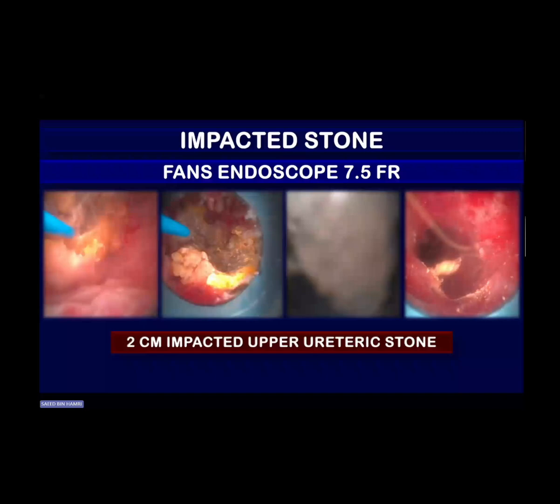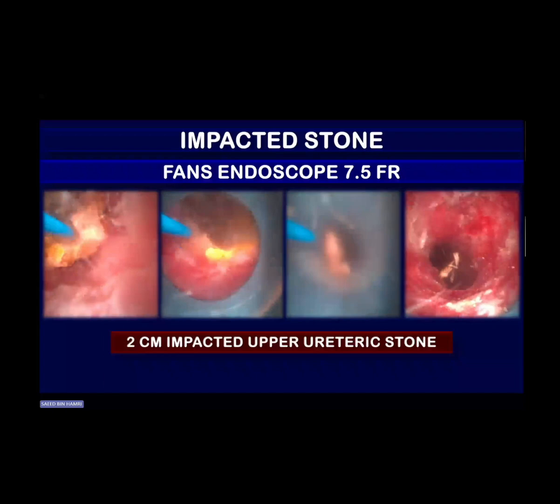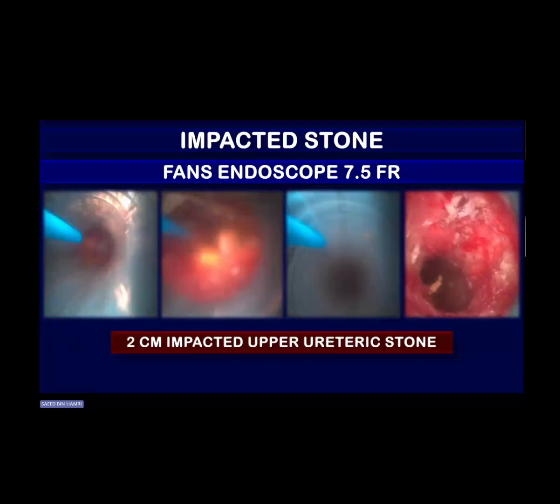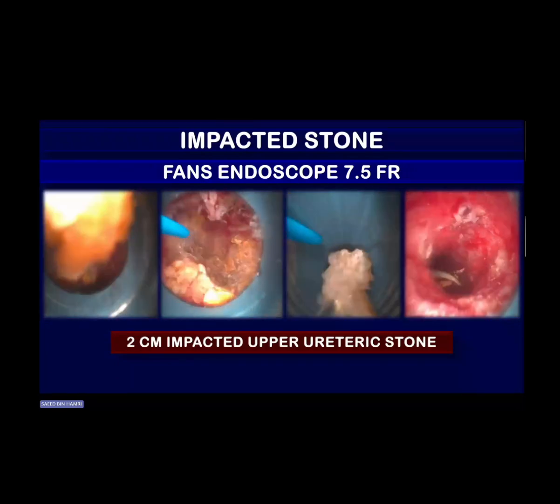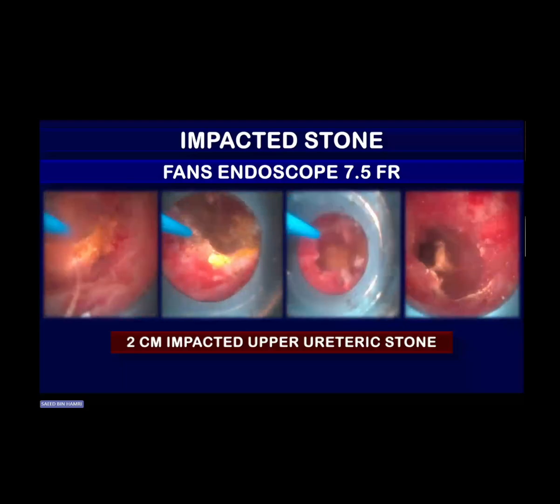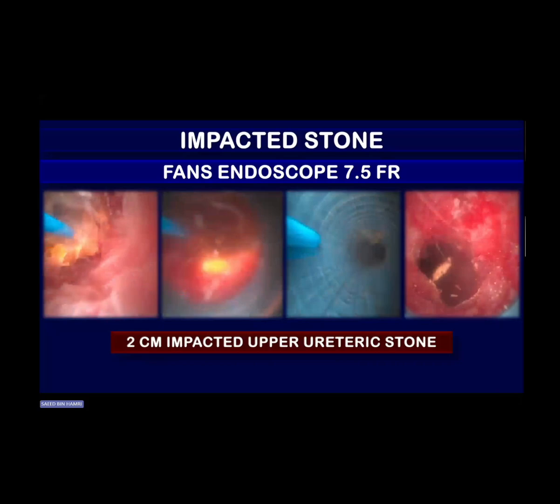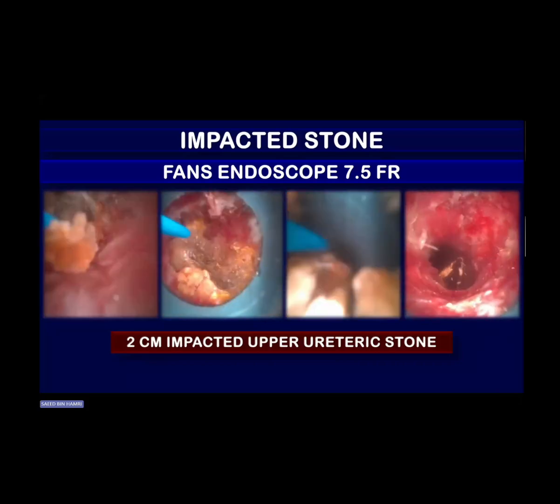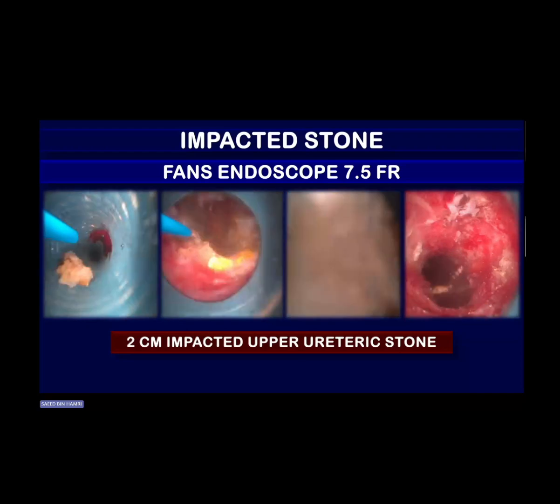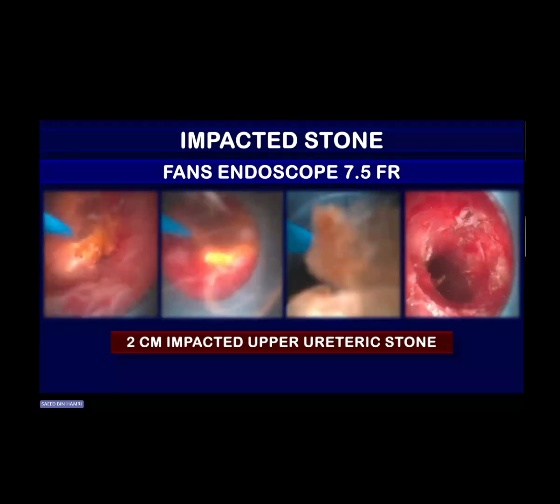But again, I say that these are tools. We cannot blame tools. We blame the person driving the tools. If you are driving a 7.5, you could do more injuries than a wise surgeon driving a 9 French. So it's not only about the size of the tool, Majid. It's about how you deploy these tools inside the practice. Now, the smaller size comes to you not to reduce your complications. It came to help you reduce the failure of access, to improve your outcome.